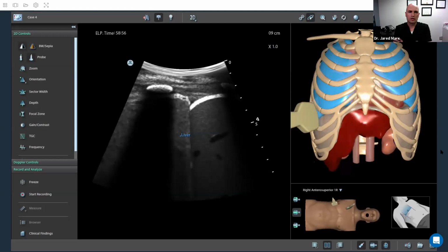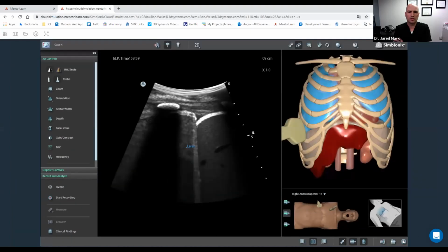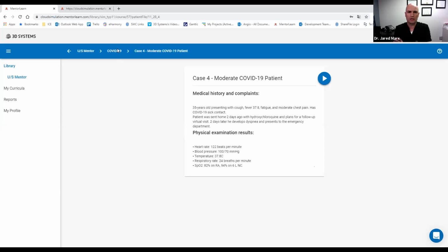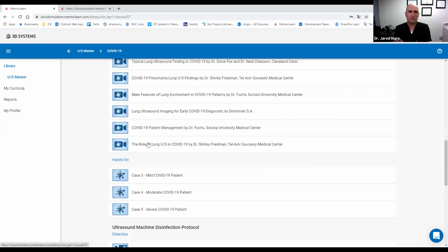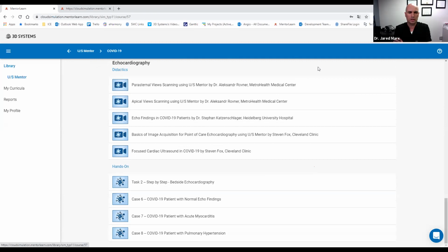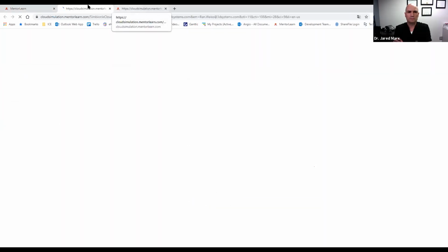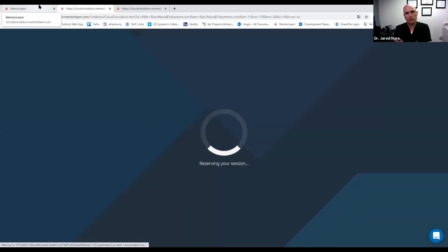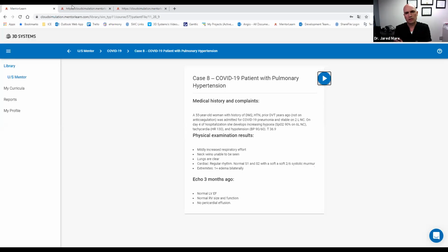Obviously in sepsis and infection, there are varying patterns as far as what the heart does. Initially, it's very hyperactive and typically has a high output. And then as it progresses, they can progress to a cardiomyopathy. We're going to look at an example. I think you put in a pulmonary hypertension case. Unfortunately, I have seen similar findings in my COVID patients. Unfortunately, they're not the ones that have fared well with the disease, but they will have some of the findings we'll see here.